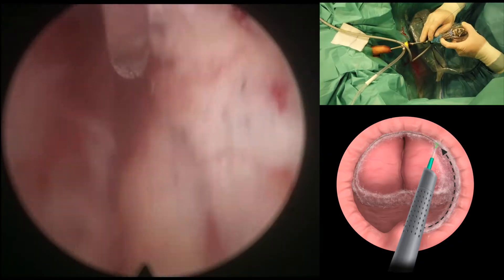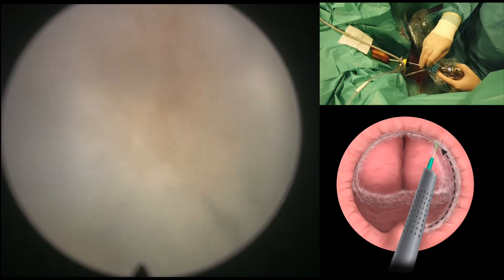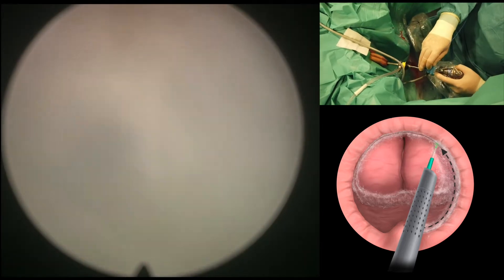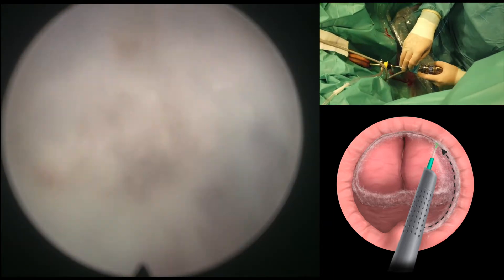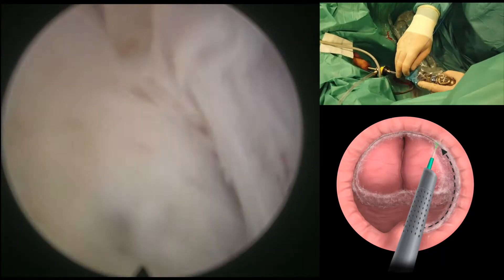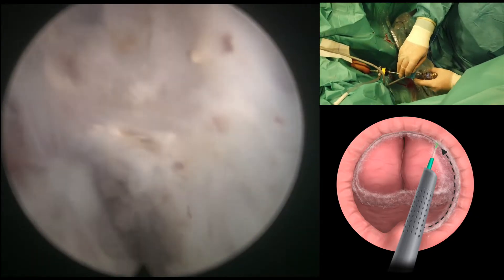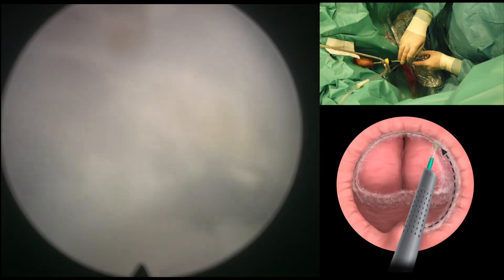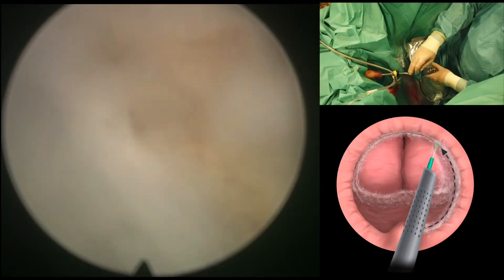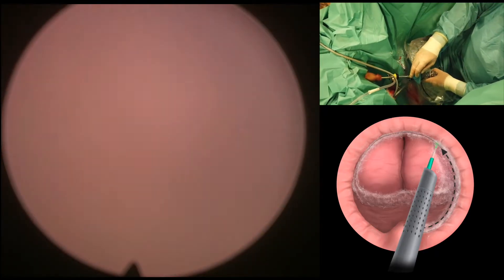Here we want to protect the sphincter and as we come more anterior the cutting has to be a little bit more horizontal. Initially we do a cut even a little bit into the adenoma — we don't mind — because that will give us some space to access the apex and to develop it carefully with the energy of the holmium laser. In this case we are using a pulse modulated laser: the Quanta system 150 watt laser at settings of 2 joules and 50 hertz with the virtual basket setting.